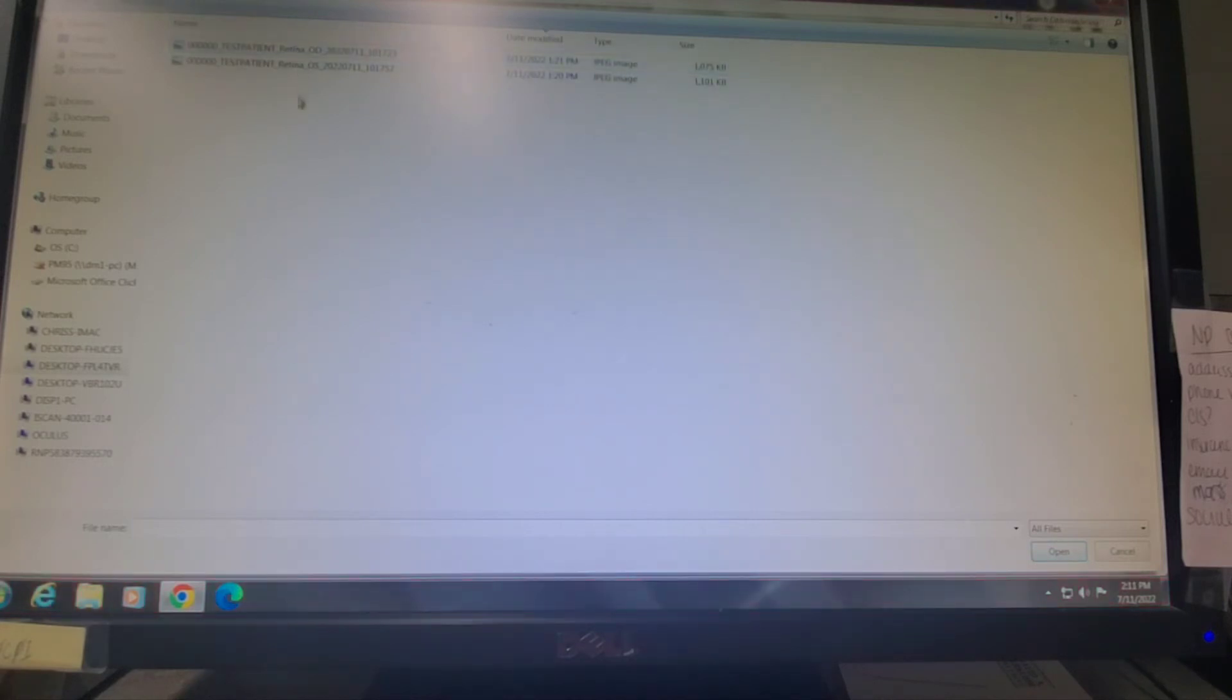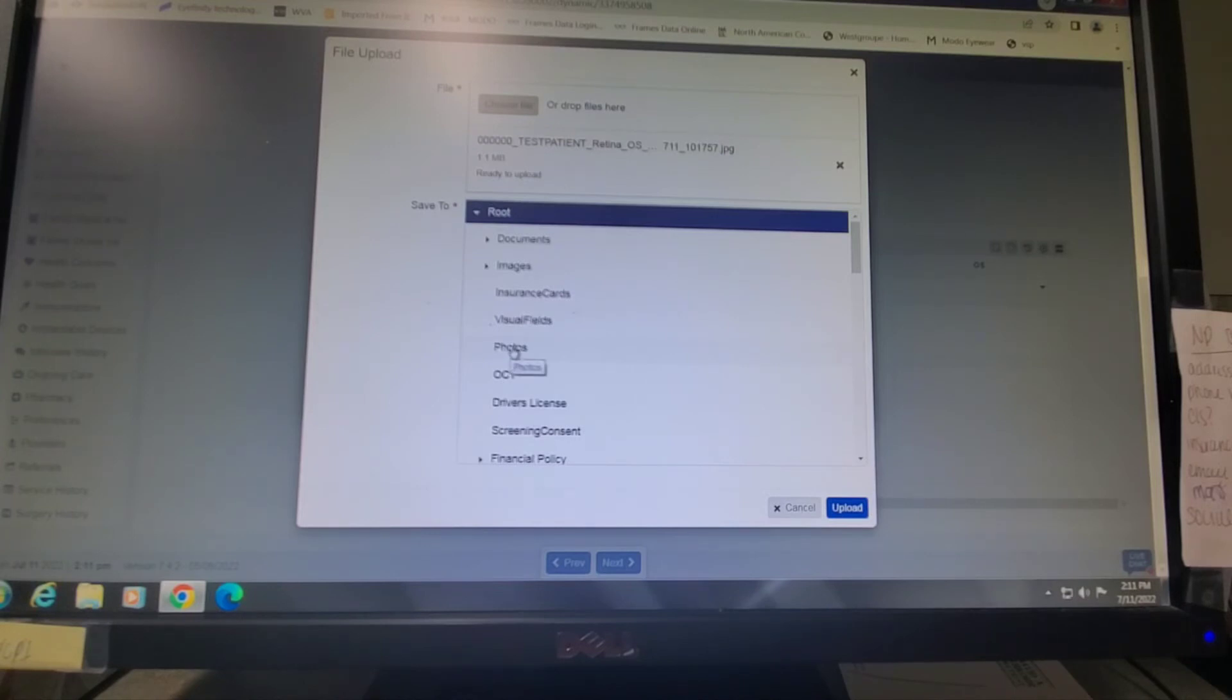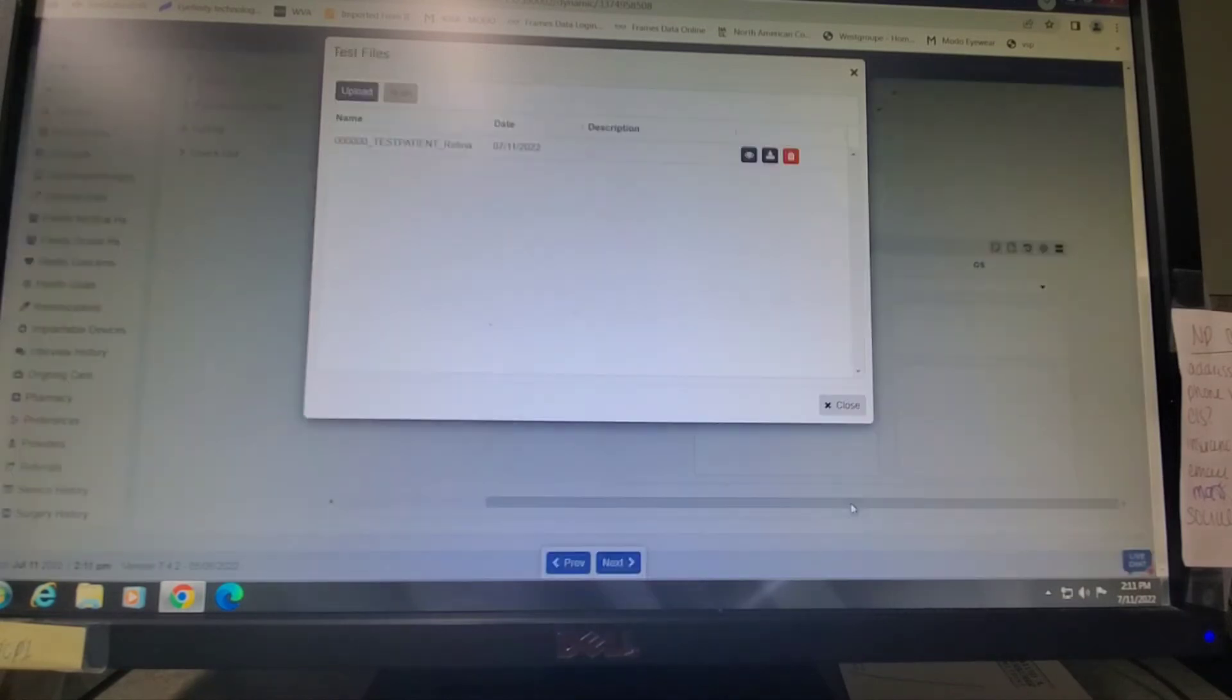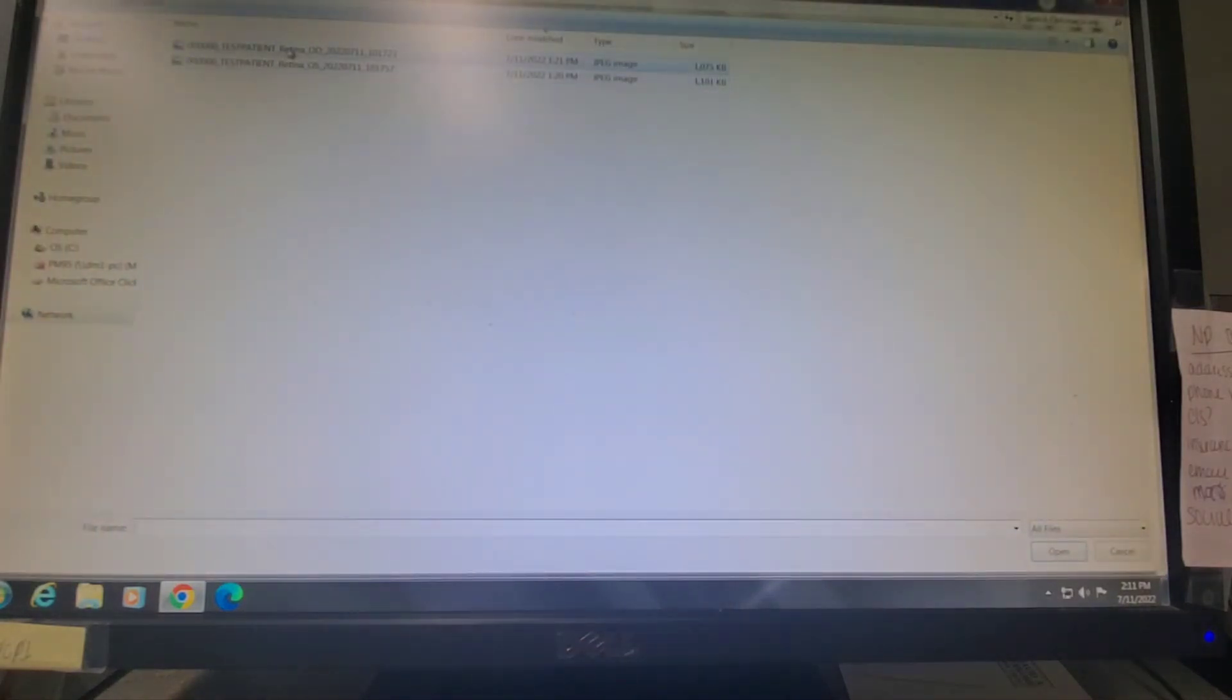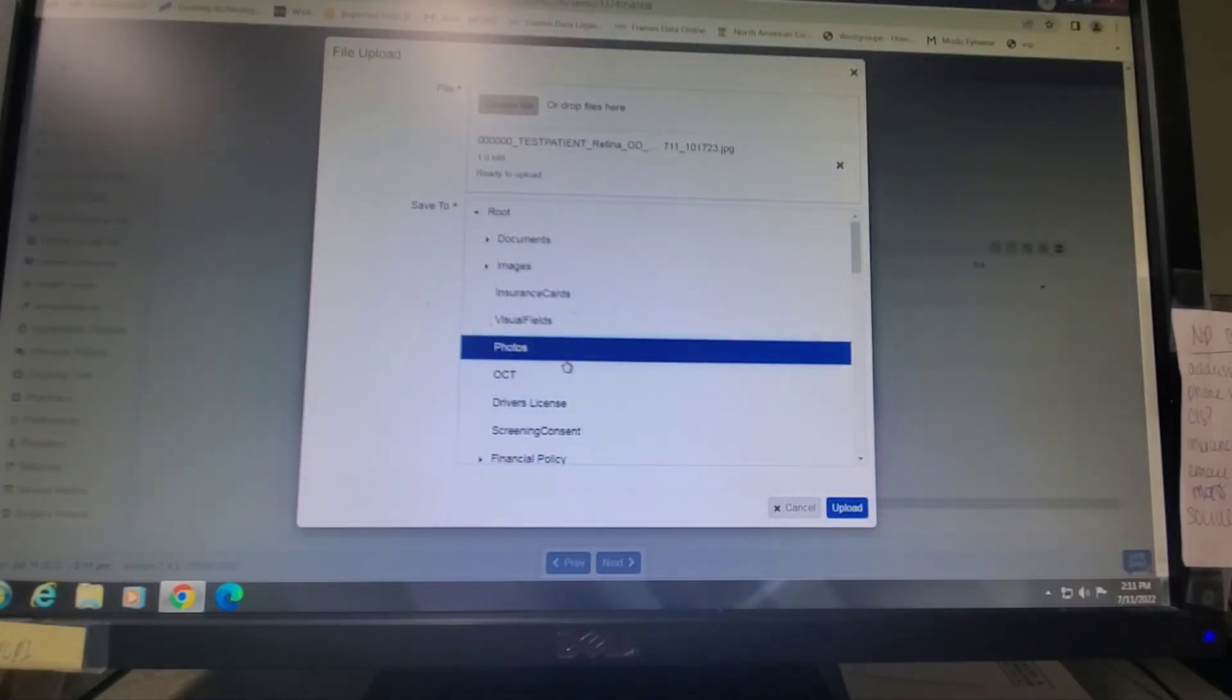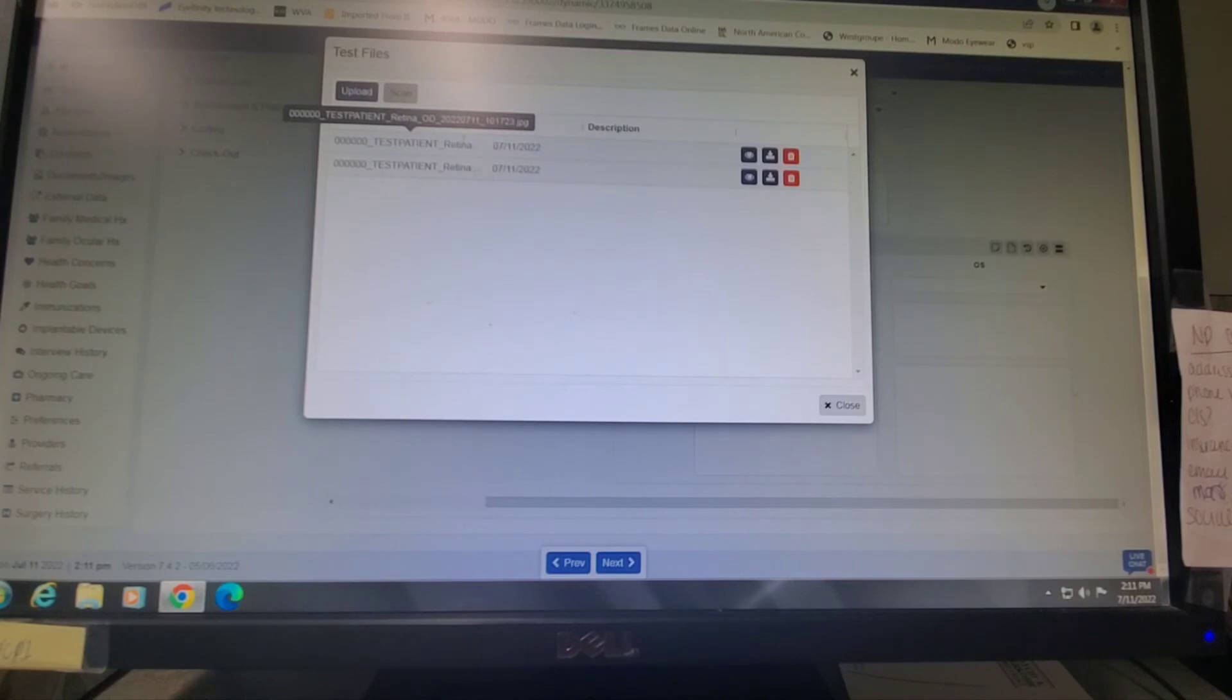Now you'll have the list of the photos that were exported. We want to upload the left eye first, so OS. Then we need to assign it to the photos folder. We'll click on photos folder and then click upload. Then now we need to upload the right eye. We'll go back to upload, choose file, click on the right eye, assign it to the photos folder and click upload.